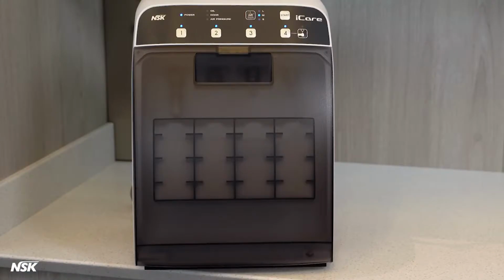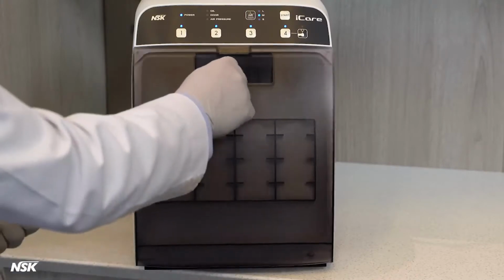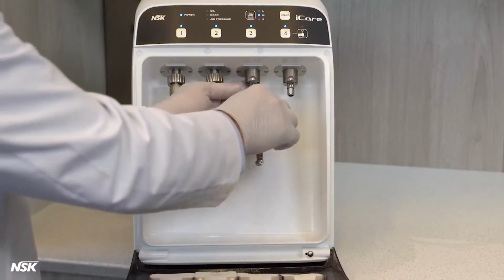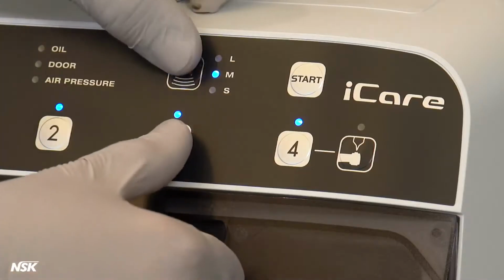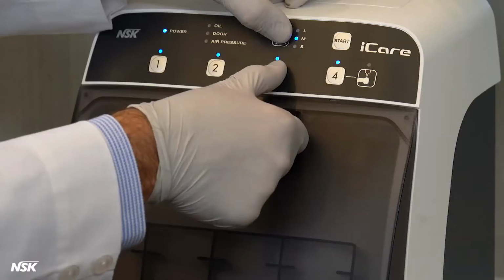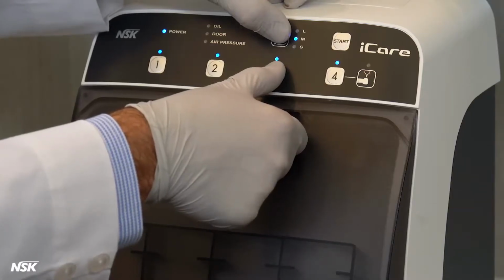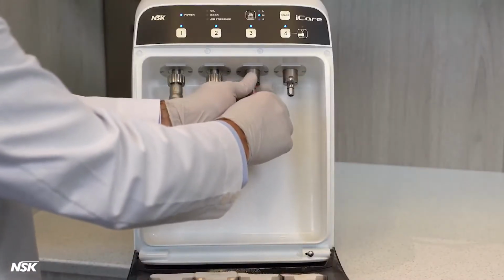Purging air only. If you notice a little excess oil left in the handpiece, you can purge extra air through it to clear out the excess oil. Connect the handpiece to one of the ports. Close the door. Press the port button where the handpiece is connected and air button at the same time for a few seconds. Pressured air will purge any excess oil out of the handpiece. Open the door and remove the handpiece.